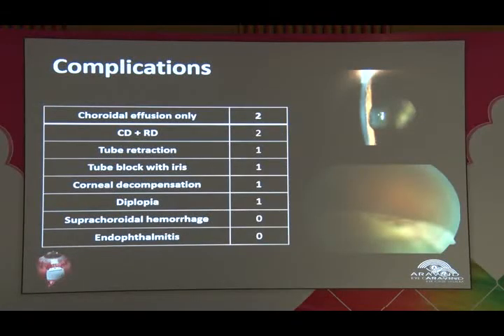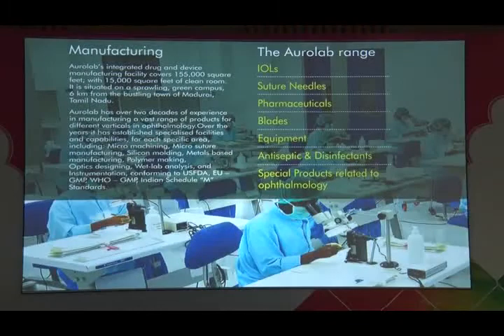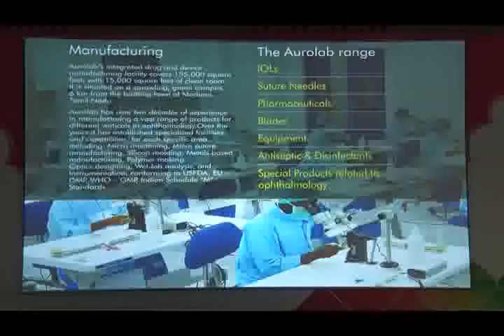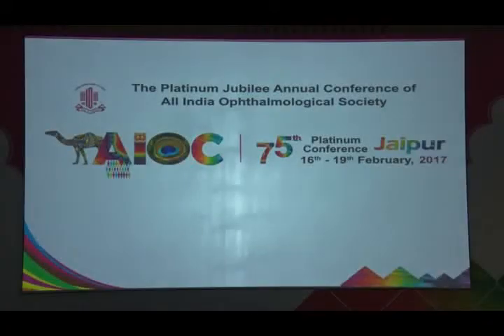But of course, in the initial learning period, we had some complications like choroidal detachment and tube retraction, and also blockage with the iris, which were easily managed, except for two cases in which we were not able to save the eyes. It's also CE marked now, and I'm very happy that the company came forward in making this implant with us for more than 2 years, and finally we have come up with a very good, well accepted implant at a leading institute in India and other countries. It's one of the best implants available, especially in developing countries, for managing intractable glaucoma. Thank you very much.